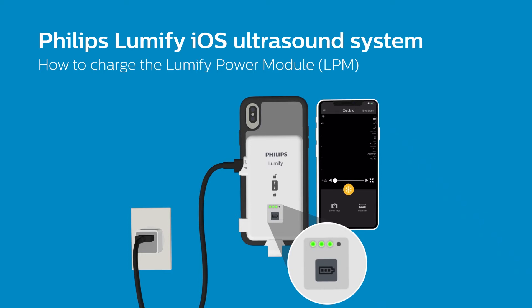For example, one solid LED equals 25% charge, two equals 50%, and when all four LEDs are illuminated, your power module is at full charge.